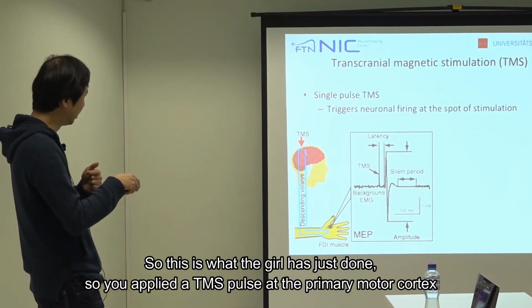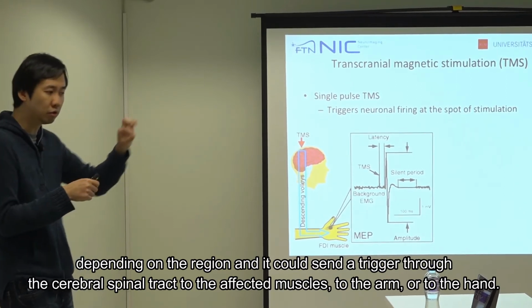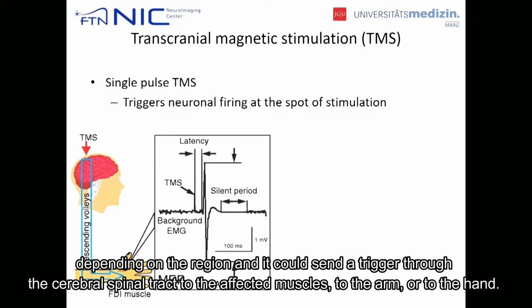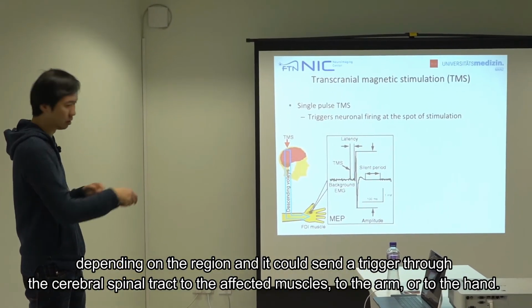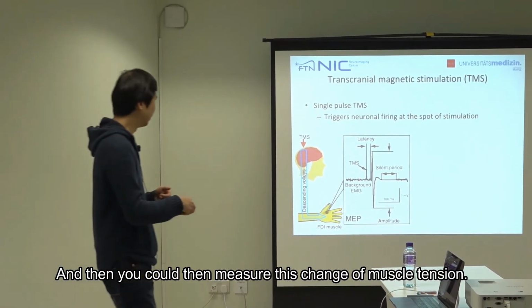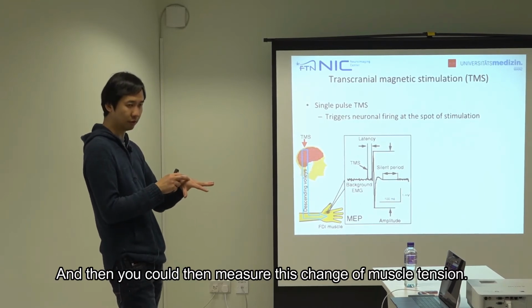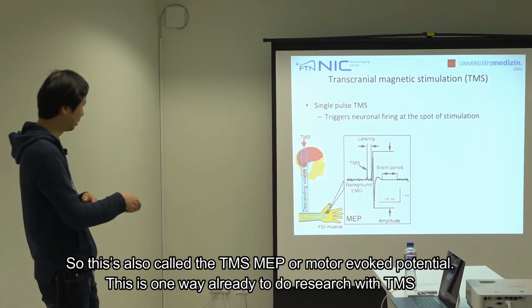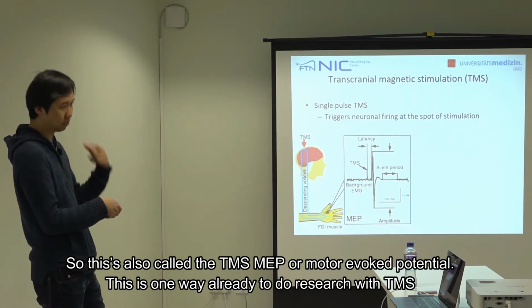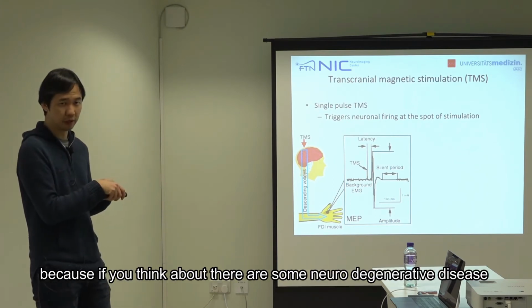So you applied a TMS pulse at the primary motor cortex, depending on the region, and it could send a trigger through the corticospinal tract to the effector muscles, to the arm or to the hand, and then you could measure this change of muscle tension. So this is also called TMS MEP, or motor evoked potential. This is one way already to do research with TMS.